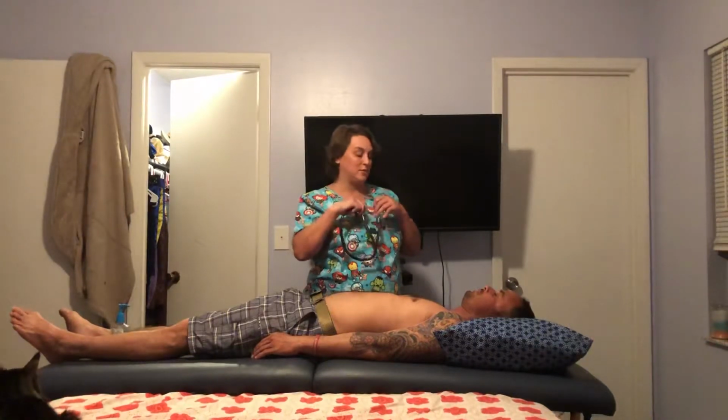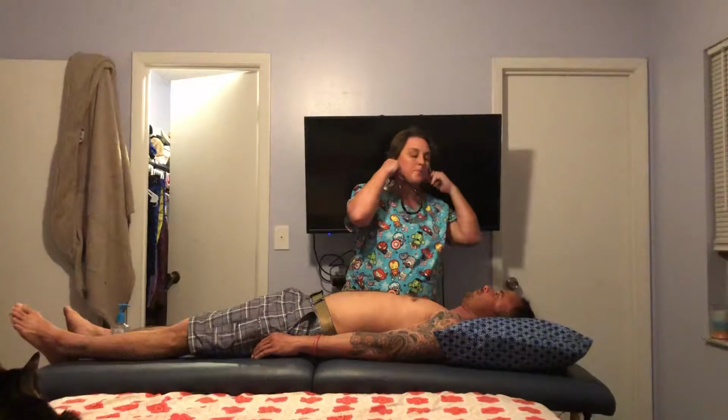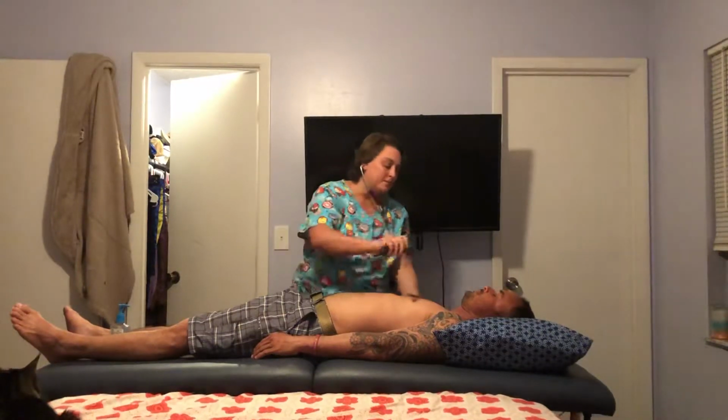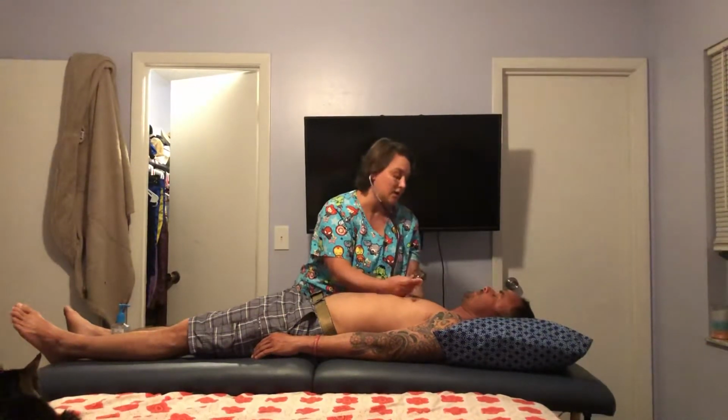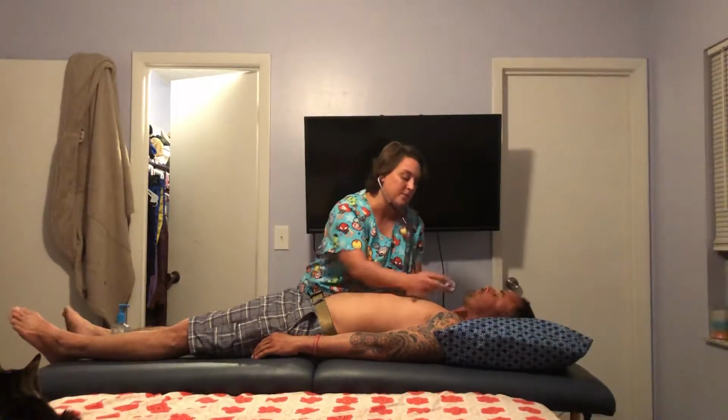Don't detect any murmurs. I'm going to go ahead and listen to your lungs at this time. I'm going to start at the apex of your lung. Every time you feel my stethoscope, I want you to take a nice deep breath, okay?